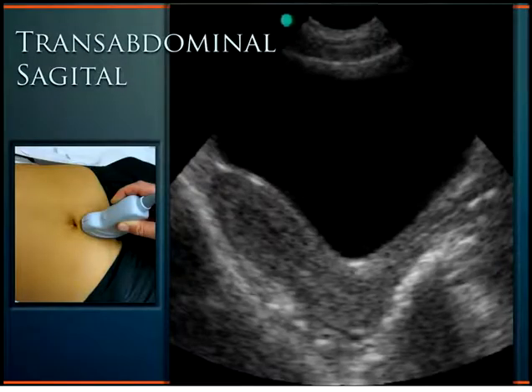Now, with the female pelvis in the sagittal view, we now have the organ stretching out on its long axis. So what we see here is the bladder as a triangular shaped structure because it's now sagittal.